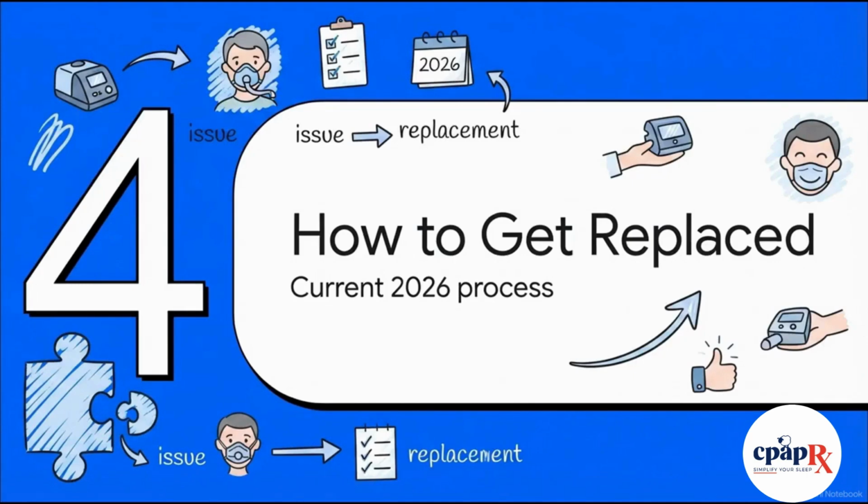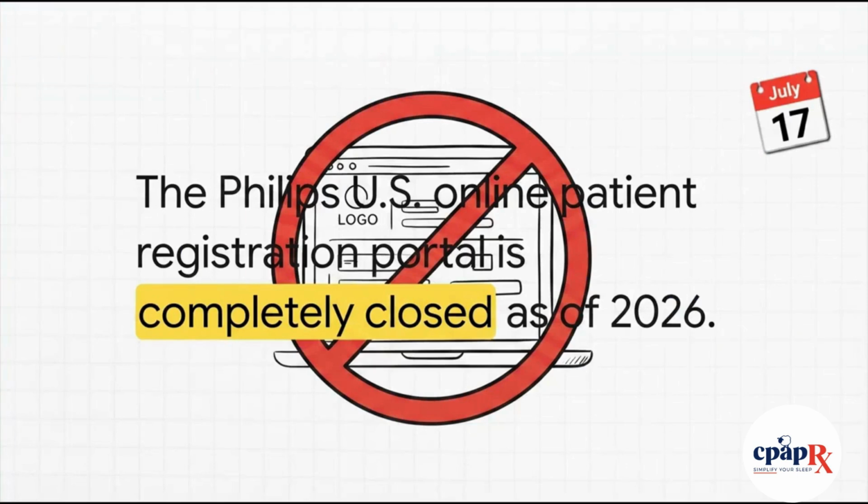Okay, so let's say you're affected. How do you actually get a safe replacement today, now that we're in 2026? Well, here's the most vital operational update for you. That automated online U.S. patient registration portal that Philips was promoting everywhere a few years ago, it is officially and completely closed. The formal registration deadline is gone, so if you're just discovering this recall today, or if you just assumed your machine was waiting in some digital queue somewhere, you can no longer rely on that portal.